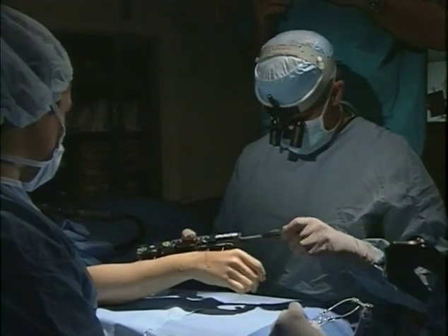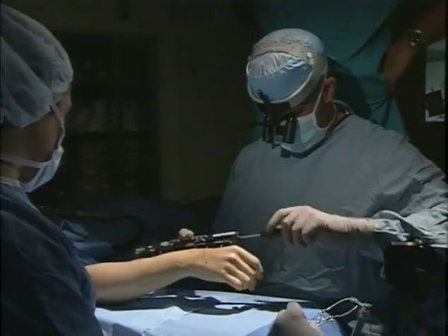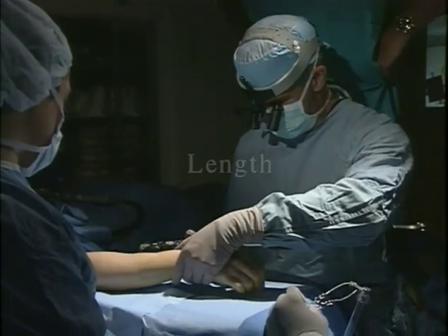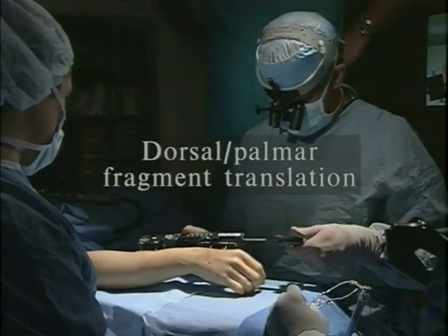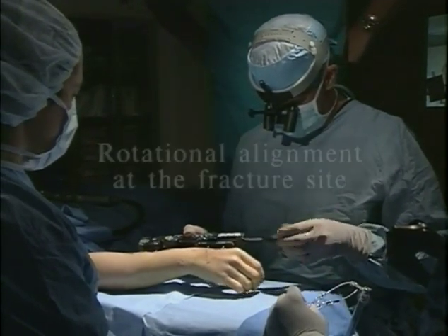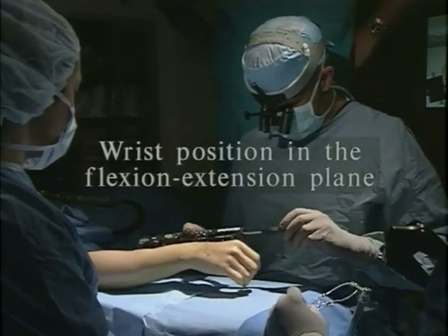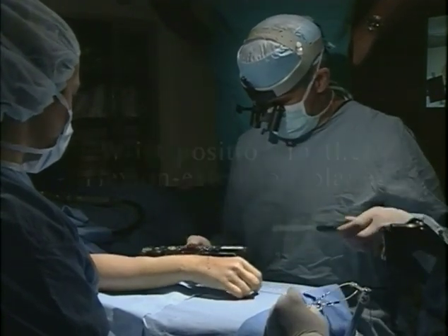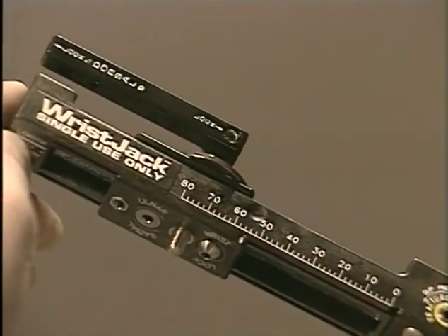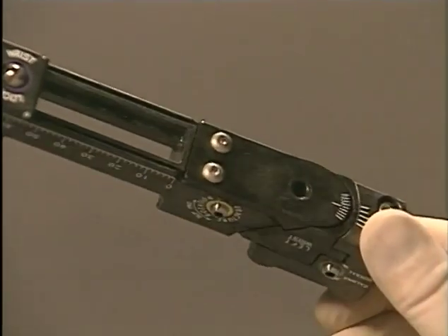Its biomechanical design complements the anatomy of a fracture of the distal radius. The wrist jack's gear mechanisms permit independent adjustment of length, dorsal palmar fragment translation, radial ulnar fragment alignment, rotational alignment at the fracture site, and wrist position in the flexion extension plane. The AG wrist jack is molded of a high performance engineering resin that permits steam sterilization and radiographic translucency.